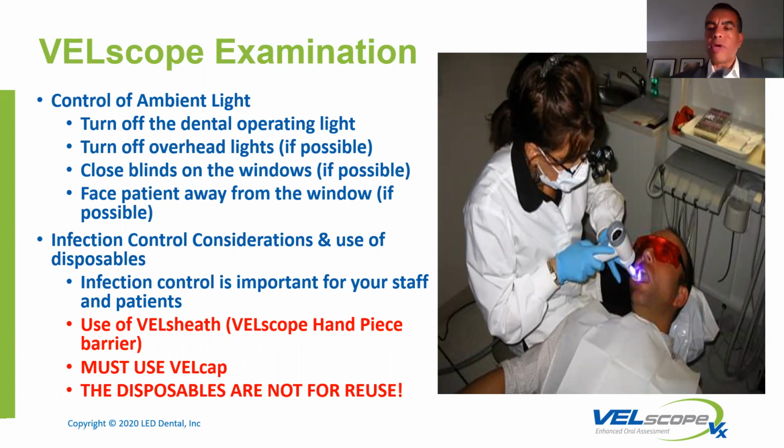Lastly, one of the things I want to stress is the disposables obviously have 2 points. We're trying to reduce transmission of viruses and diseases. But the other thing is protecting the corrective VELscope lens. This lens here has no seal, so we never want to use any type of liquid, cavicide, or alcohol wipes in here. Please. The number one reason we find damage to this is because liquid has gone behind this and ends up killing the LEDs, and it's a pretty hefty repair.